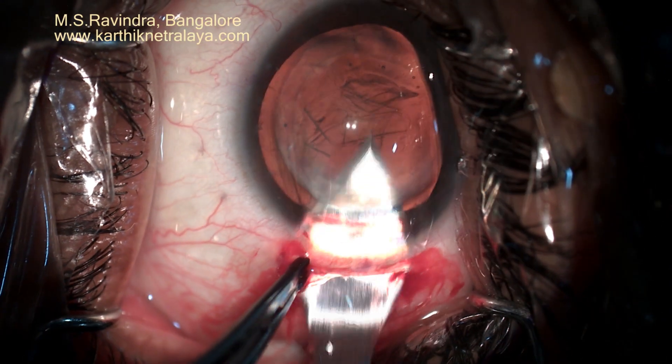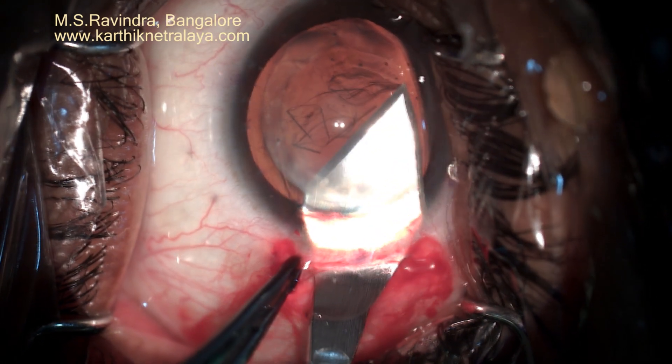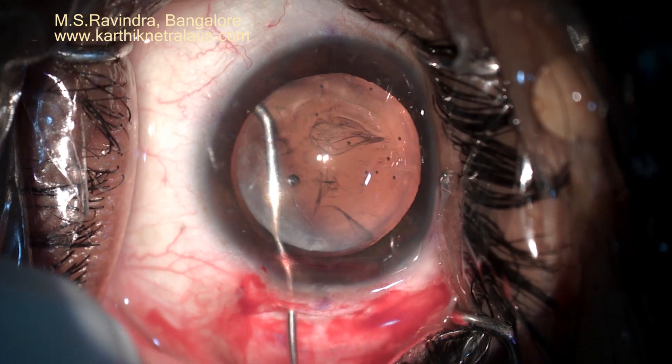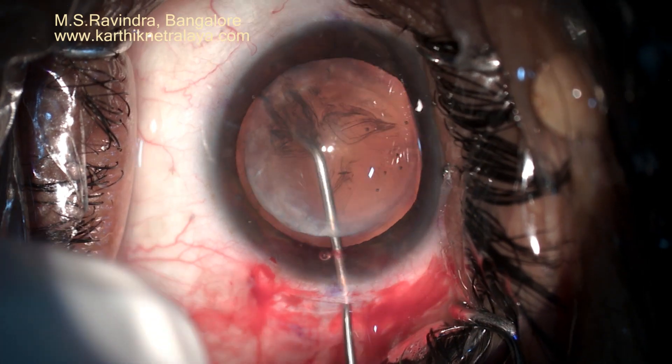The tunnel is enlarged to 6 mm. It is better to be generous with the tunnel width rather than compromising the endothelium during nuclear management.